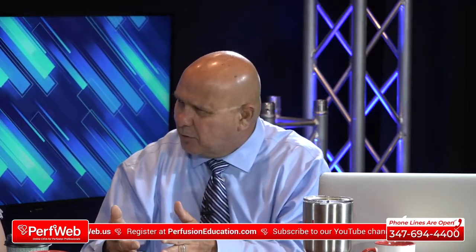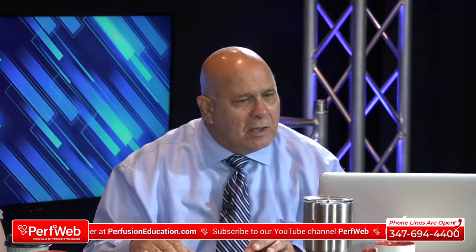But now some people used TEE. Of course, TEE is great for measuring cardiac output. Of course, that's truly the gold standard. Right. The PA catheter is the gold standard, I think, only because the PA catheter was the only thing that actually existed for so long. So it's kind of the default gold standard, but it's not a very good gold standard. You know what I mean? Yeah. Right, we accept its inaccuracy, so therefore we trust its accuracy. That makes no sense, but I guess that's what we really do.